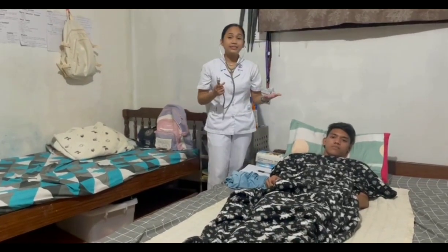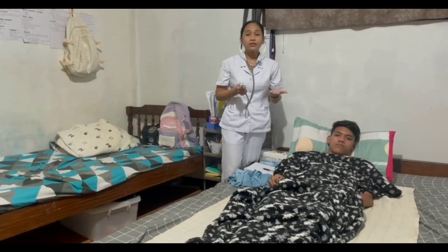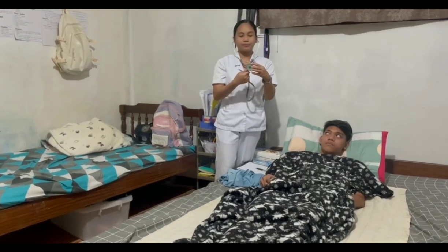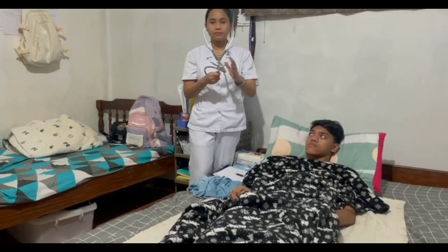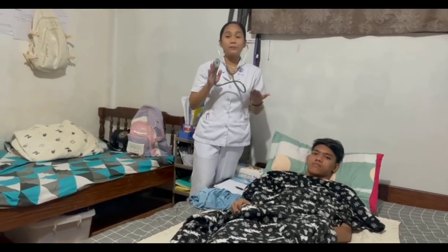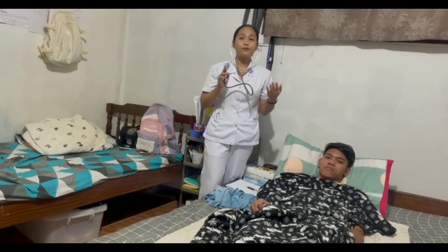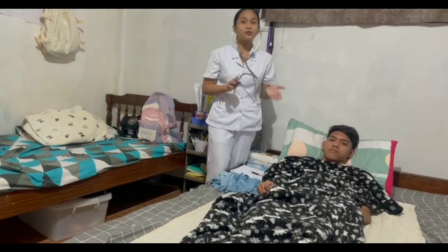And now, to listen for the patient's heart sounds, I'll be using the diaphragm of the stethoscope first, then the bell, by placing them in all 4 anatomic sites: the aortic, pulmonic, tricuspid, and apical.